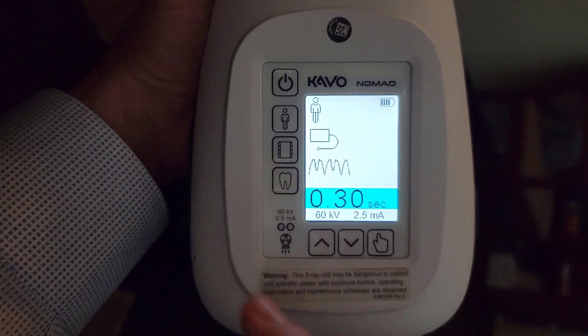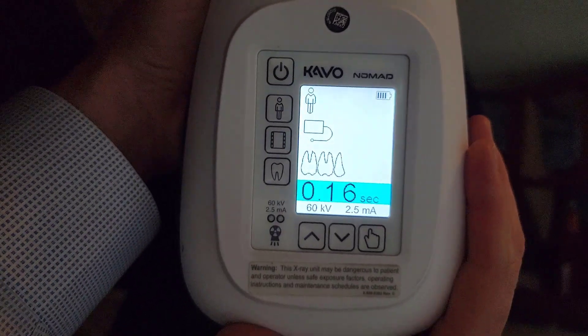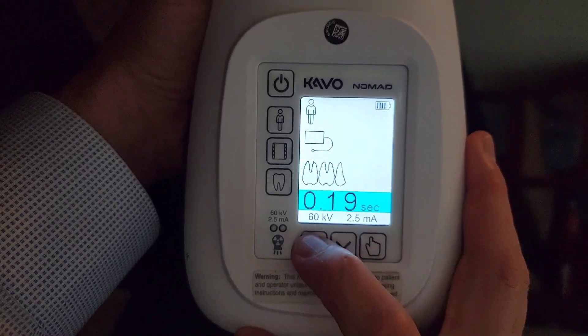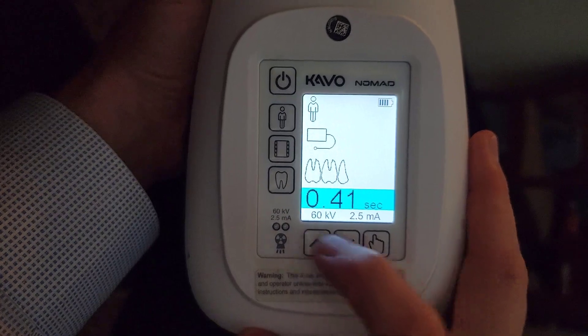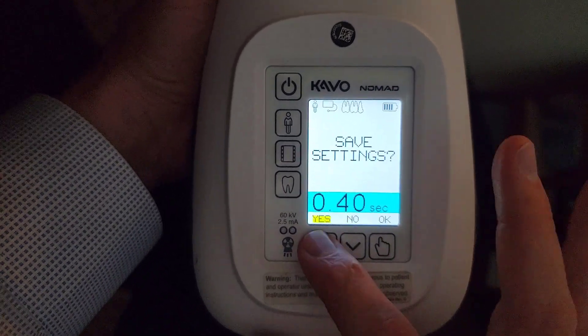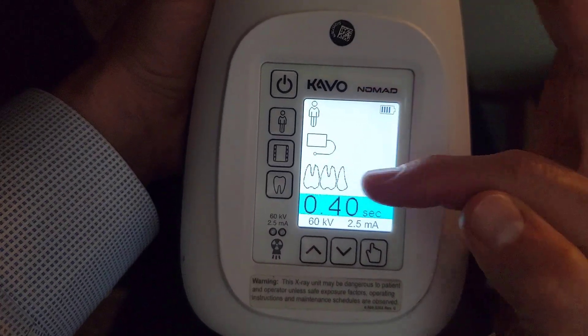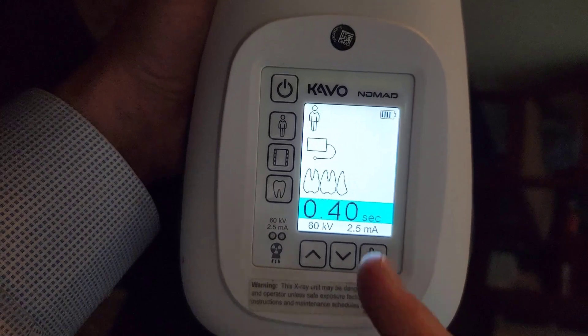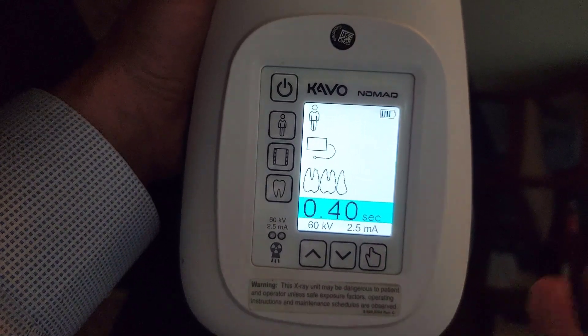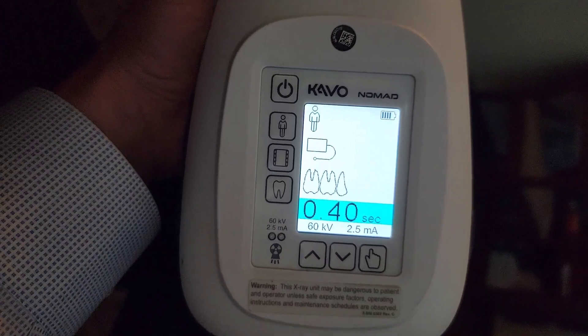So let's do posterior periapicals, and I want that at 0.4. Change that, hit the select button just once. Save setting — yes — okay. And there my adult digital posterior PAs is now set as the default. So you can turn this off and back on and it's going to go back to 0.4 seconds.